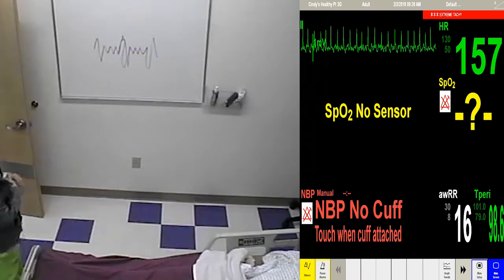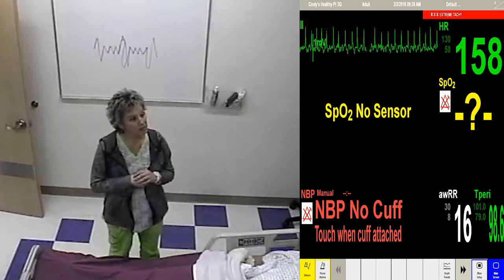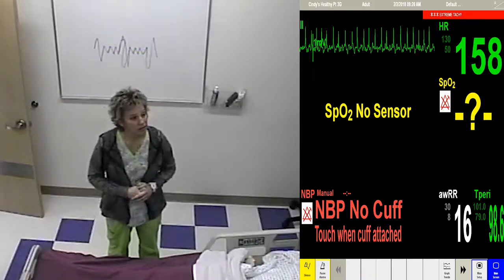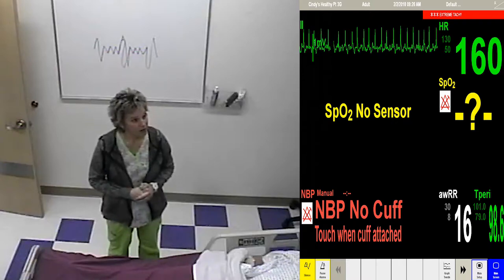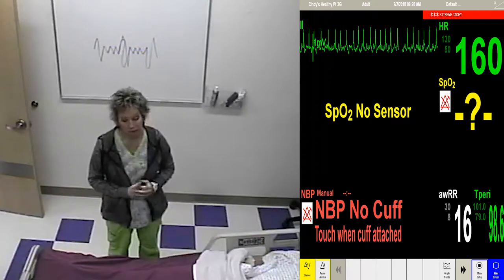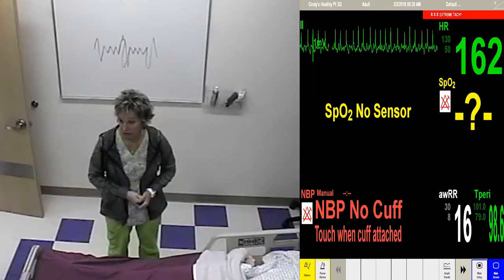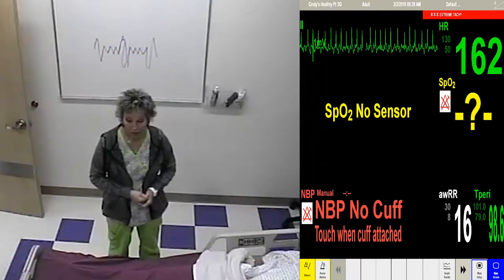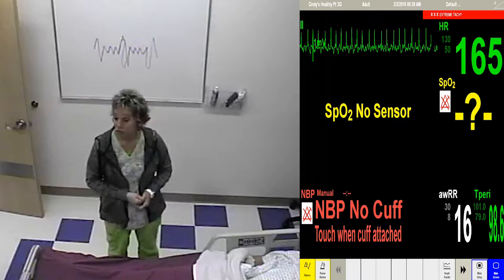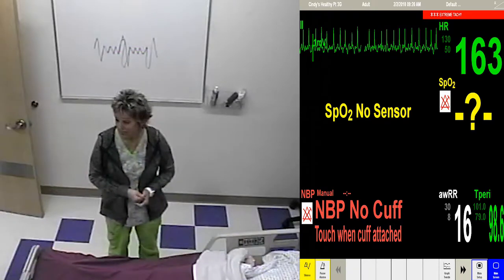Okay. Now starting. Are there P waves? I'm not sure. Are there QRSs? Yes. Are there T waves? I'm not sure. Is there a P wave before every QRS? I don't know, I'm not sure. Is there a T wave after the QRS? I'm not sure. Bob your head to the beat. It's not regular. Okay, so is it regular? No. Did you answer yes to all of those questions? No. So is there any way this is sinus?